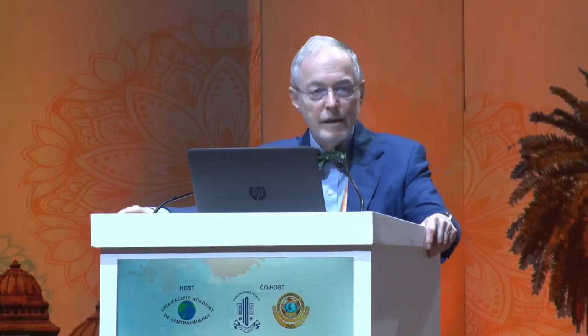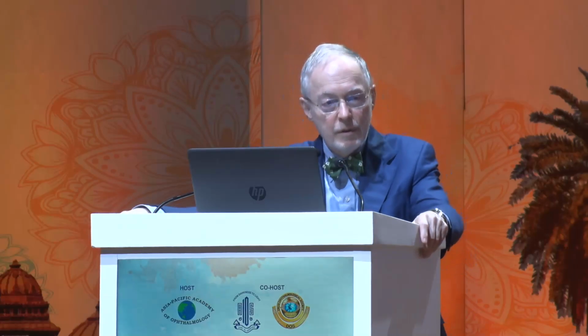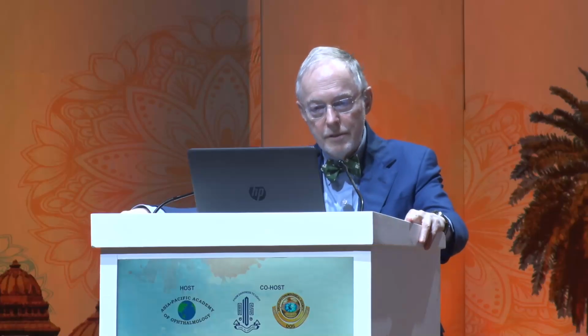But particularly with the Zeiss laser that does PRESBYOND, people are treating very high amounts of hyperopia, and the greater the hyperopic treatment, the more error you're going to have in your postoperative IOL calculations. Like everyone, first of all, thinking about the IOL, look at the corneal asphericity.